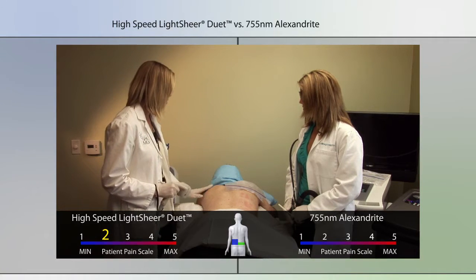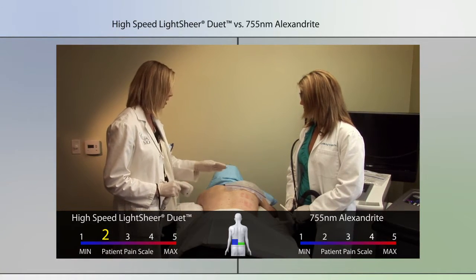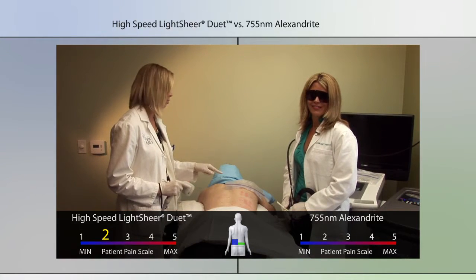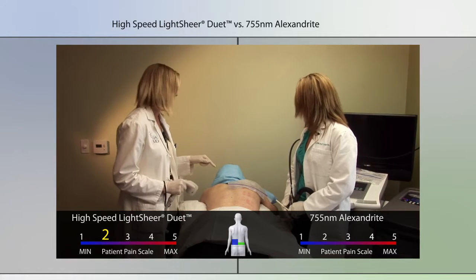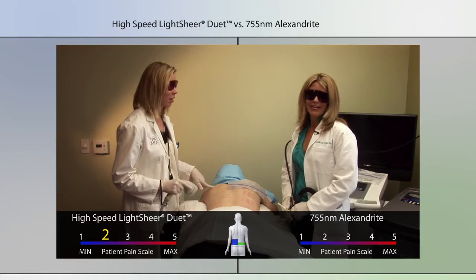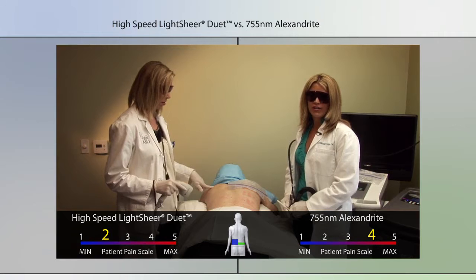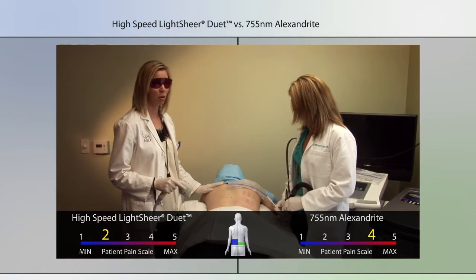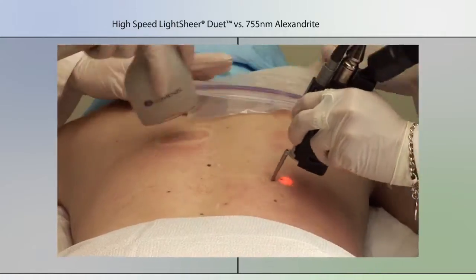And then if we may ask you on Laysan's treatment side, which is using the Alexandrite 755 nanometer wavelength, on a scale from 1 to 5, what is your discomfort level? He indicates a 4 on a scale from 1 to 5, with 5 being the most uncomfortable. So he's being very brave, but we'll go ahead and continue with the treatment.